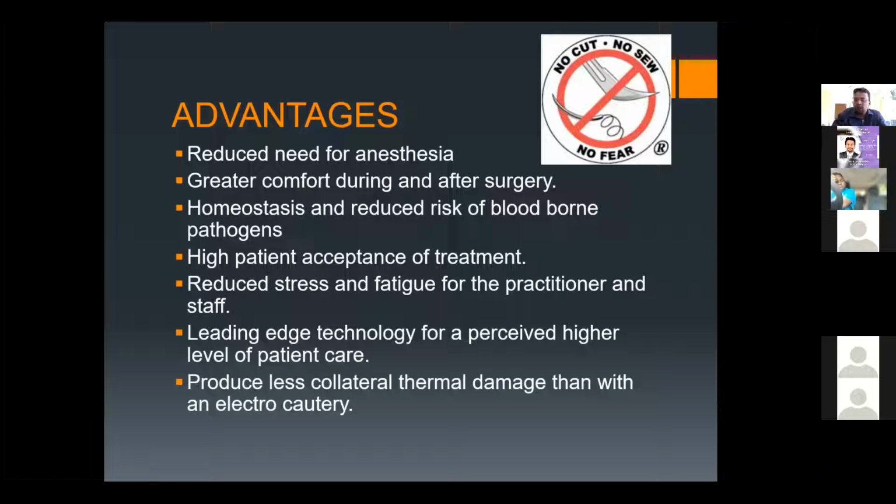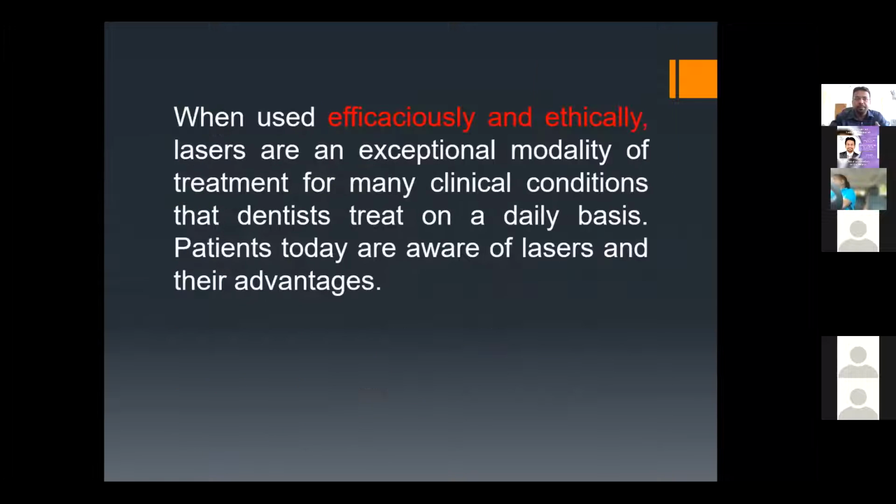It produces less collateral and thermal damage than electrocautery. Then it overall improves your clinic image. Nowadays patients are Google and YouTube patients. They search everything on Google and then they come to your clinic, right? So laser overall improves your clinic image. These are the advantages of lasers.